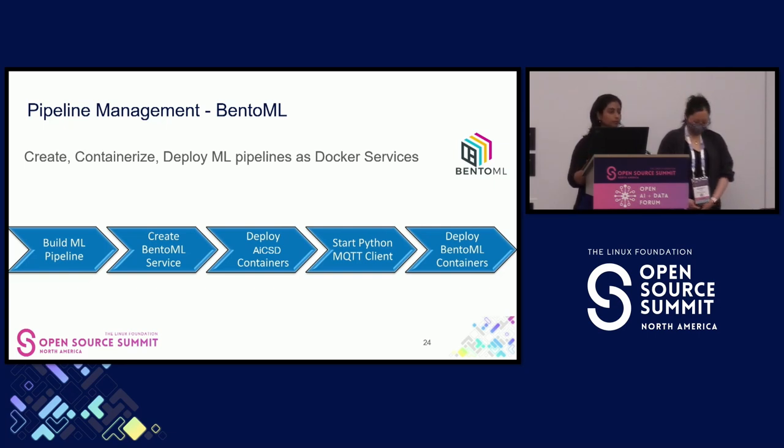So as an example, you can create a pipeline written in Python, which is doing some pre-processing and some post-processing, doing some inferencing. All of this can be converted into a REST-based service using BentoML, and then you could just deploy that as Docker containers. So we were able to integrate this tool into our solution very seamlessly.